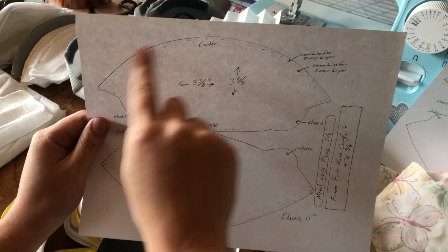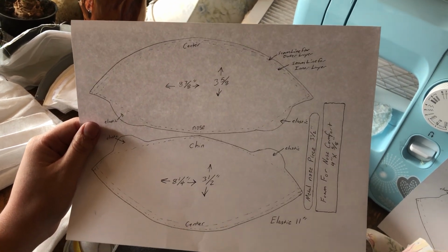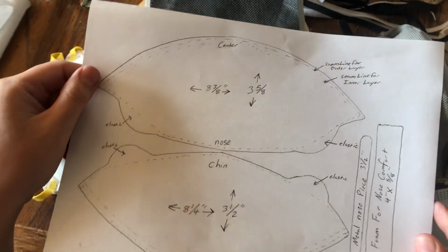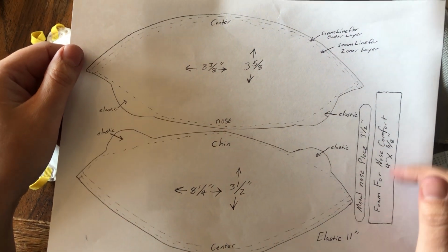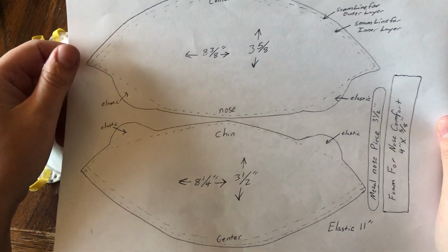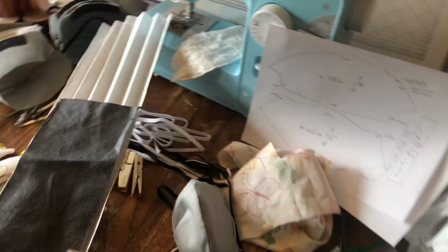I made the shape so we can get a nice cone shape out of it to keep it off your face, because otherwise you're breathing that thing in all day. Those poor people were having a hard time with it. Lay it flat so I can get a zoomed in view of the pattern. So I got the metal piece for the nose. I've got the foam piece that I'm putting on the inside, which you cannot see on these because I actually sewed it inside. So this kind of gives you your general shape.